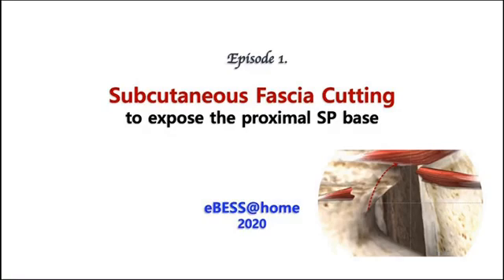The first episode we are talking about today is subcutaneous fascia cutting to expose the proximal SP base.